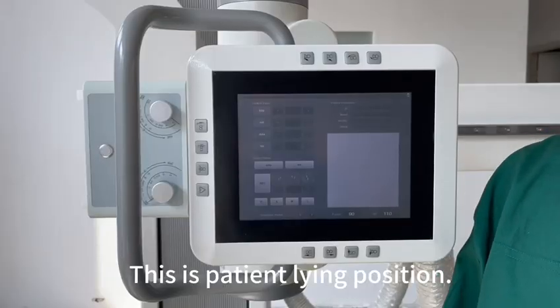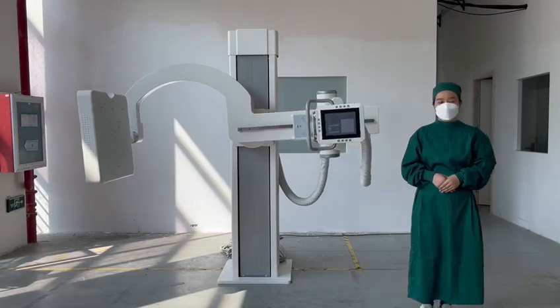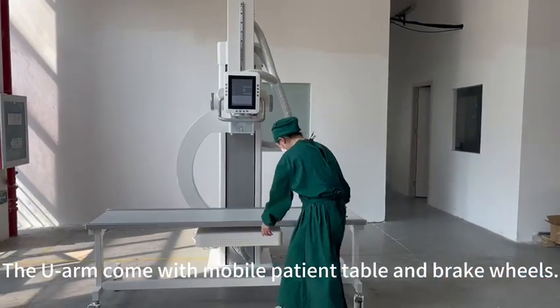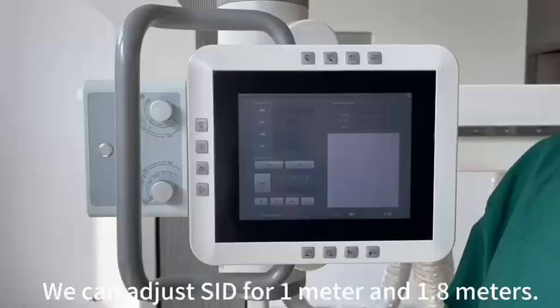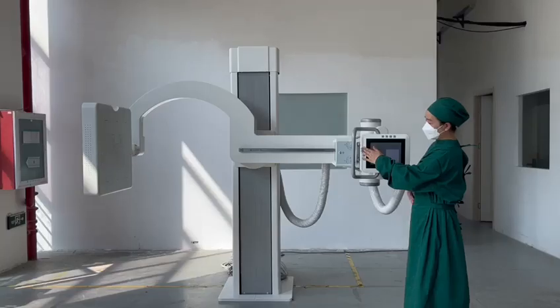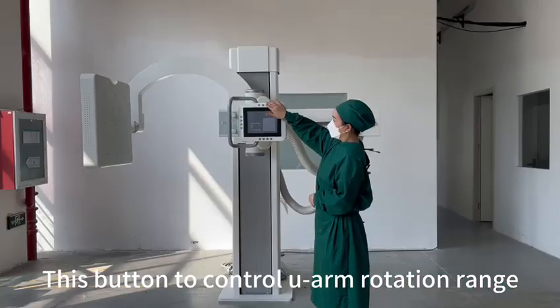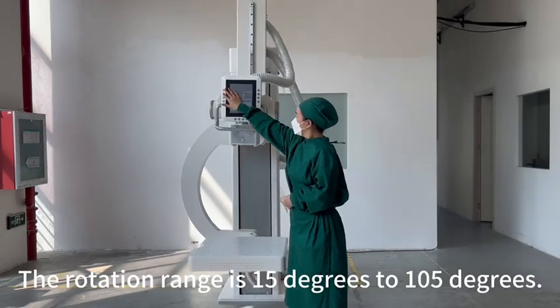This is patient lying position — press and hold for three seconds. The U-Arm comes with a mobile patient table and brake wheels. We can adjust SID for 1 meter and 1.8 meters. This button controls U-Arm rotation range. The rotation range is 15 degrees to 105 degrees.